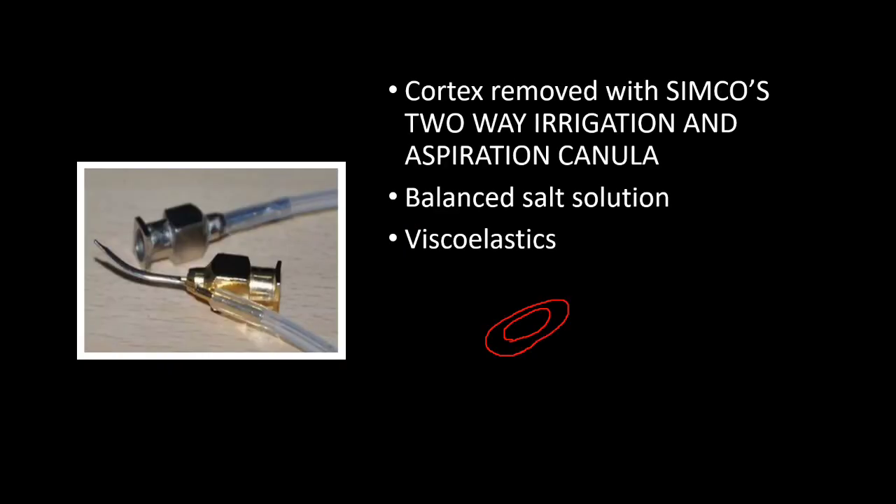After removing the nucleus, we remove the cortex using Simcoe's two-way irrigation and aspiration cannula. For irrigation, we use balanced salt solution or Ringer's lactate solution. Then we inject viscoelastic material into the anterior chamber.